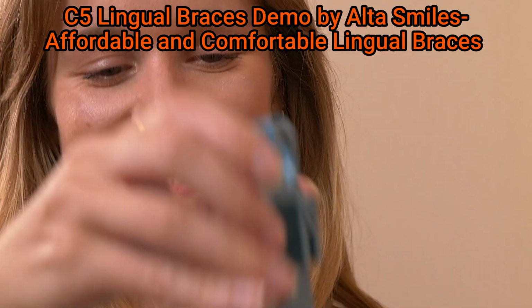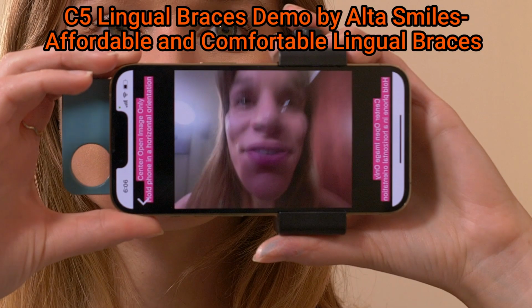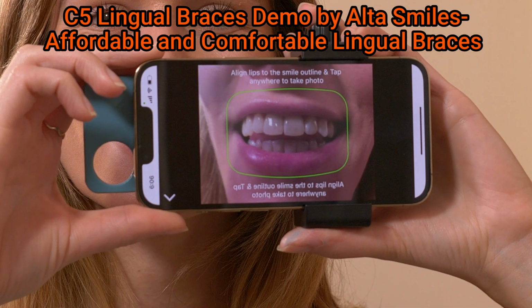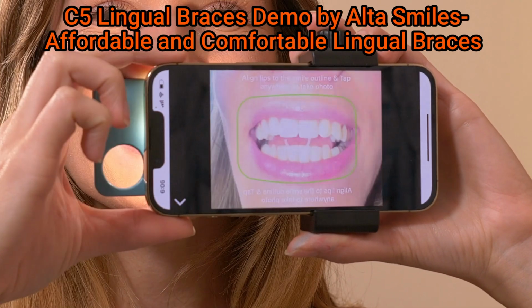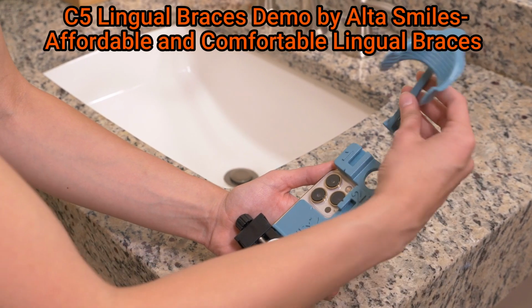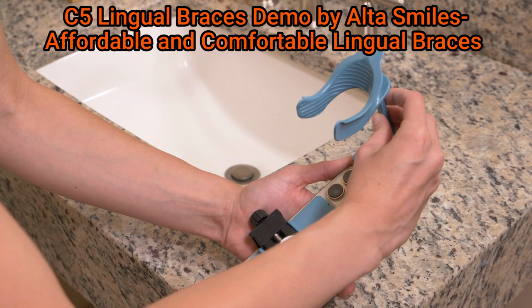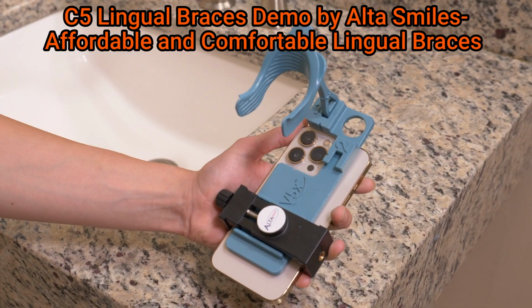After each image, you will be shown the photo. Review it and make sure it looks good. Retake the image if needed. Center open image. Open your mouth about a finger width apart and retract your lips to show as much of your teeth as possible. Use the cheek retractor attachment to take the left and right images. Match the number 1 on the attachment to the number 1 on the positioner port.